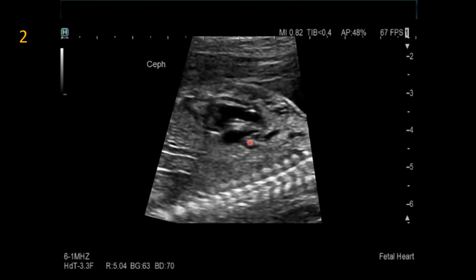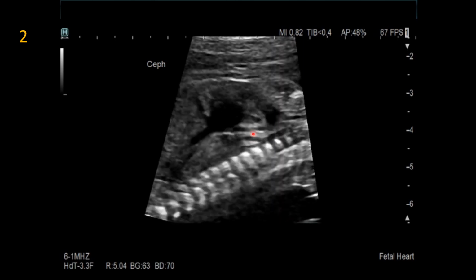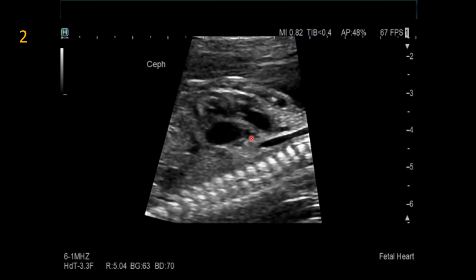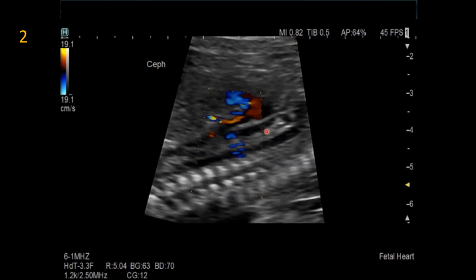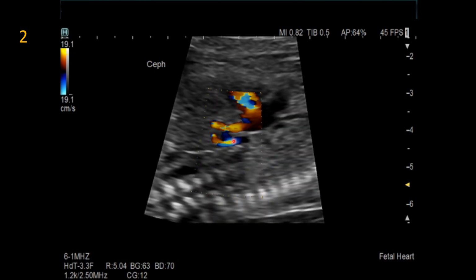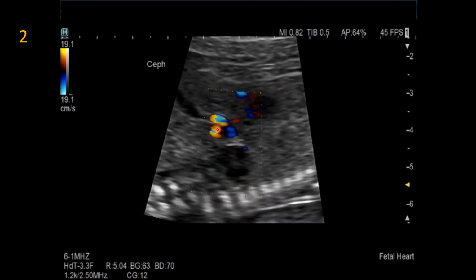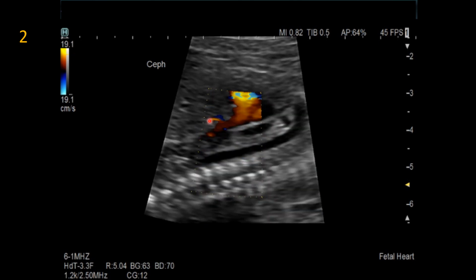Now remember, in that axial view, you saw the pulmonary veins draining into a circular venous structure, which is, in this case, a vertical vein that brings that anomalously draining pulmonary vein flow below the diaphragm. Applying color here, you can see that that venous structure drains just below the diaphragm, turns abruptly anteriorly, does not drain to the IVC, it drains to where the ductus venosus comes in. Here is the UV up here, draining to the portal sinus.